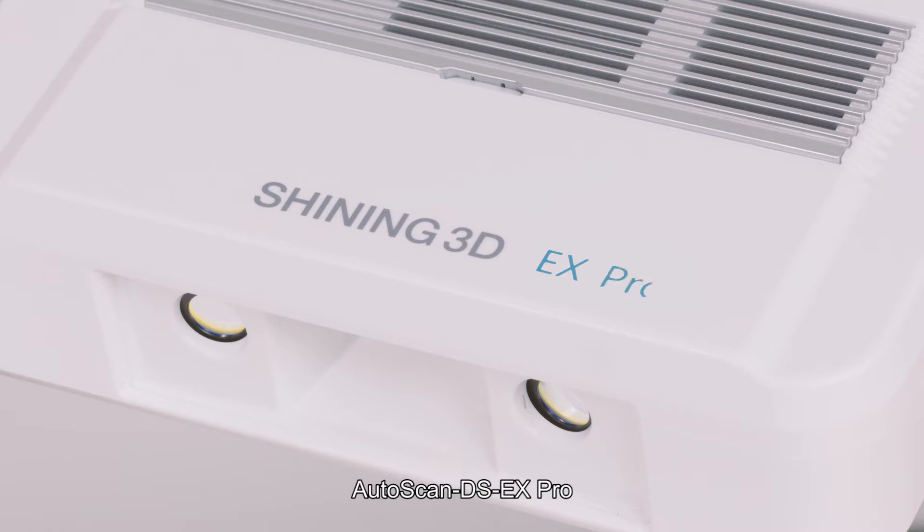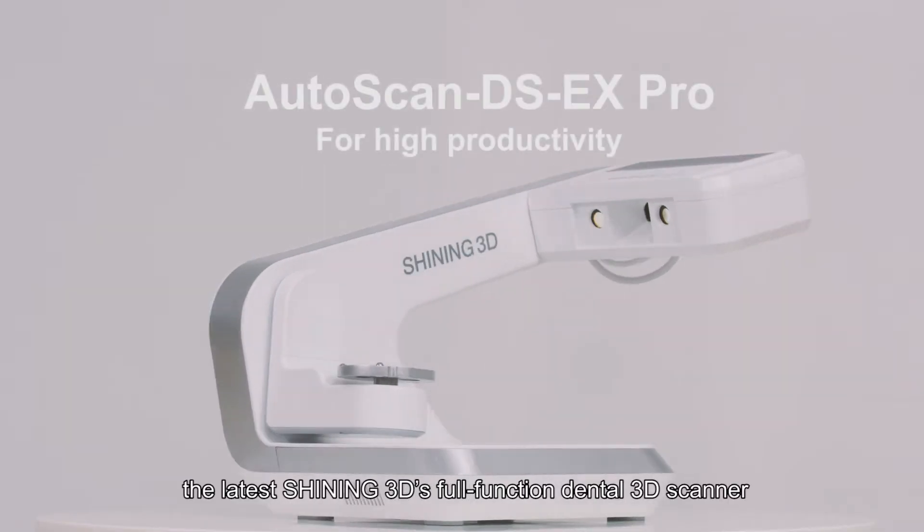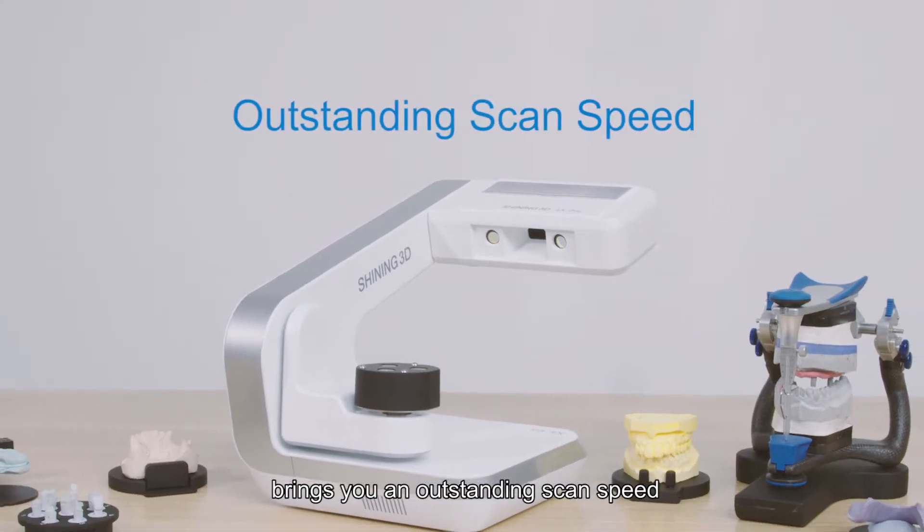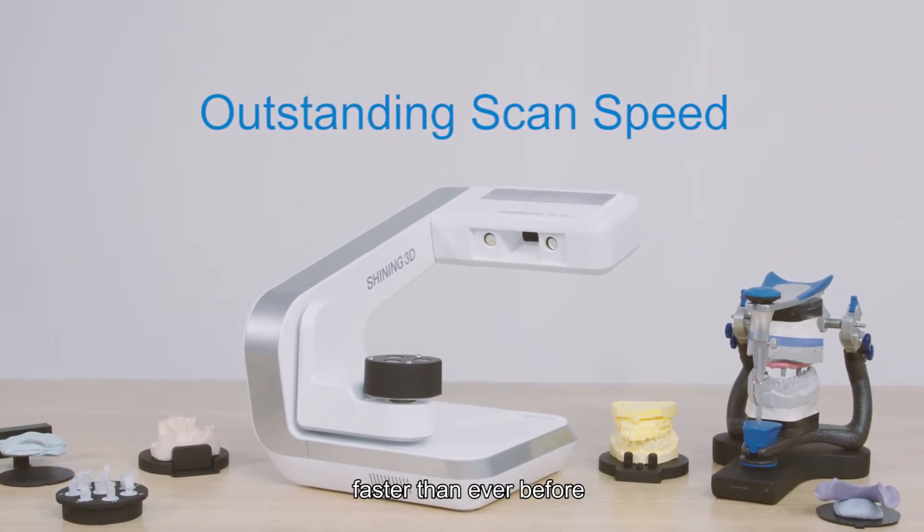Autoscan DS-EX Pro, the latest Shining 3D's full-function dental 3D scanner, brings you an outstanding scan speed faster than ever before.